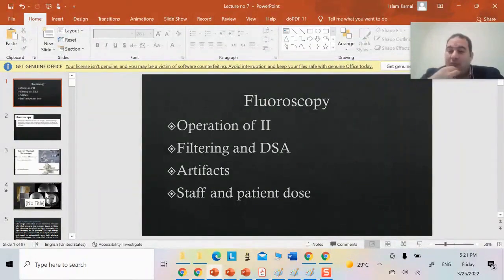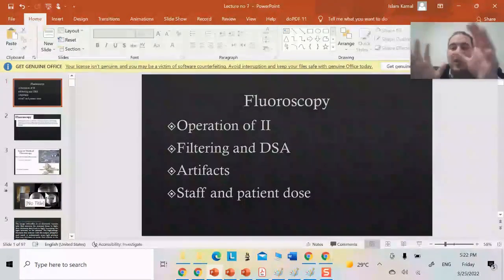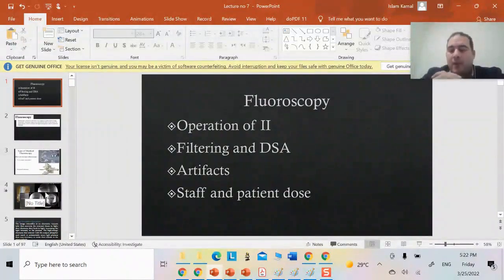I am not just taking a spot image. Yes, I can take a spot image, but in most of my work, or in the application, if I'm working in procedures and I have a patient and I want to do an injection, for example, with a certain contrast, and I want to see if there's a wire in the patient or something and I want to track it, I take a lot of spots. Sometimes I do continuous exposure to give me a dynamic image.